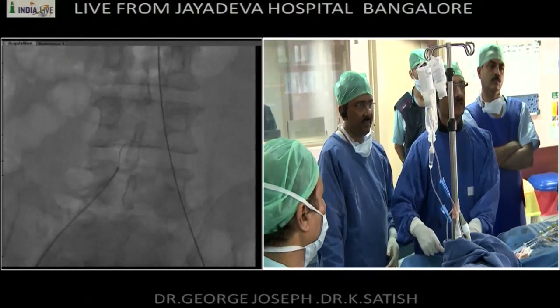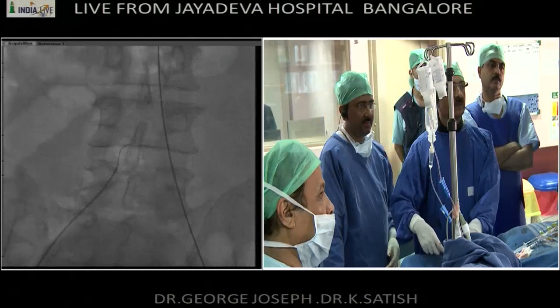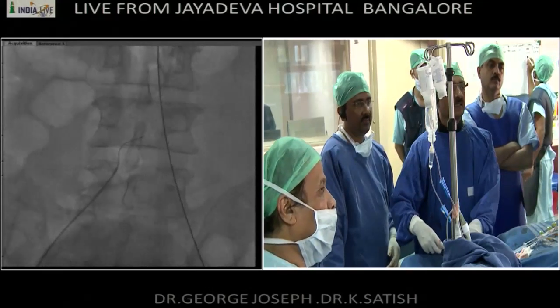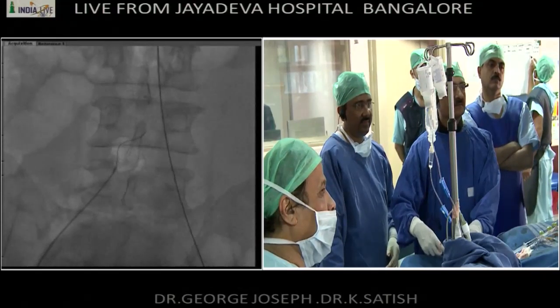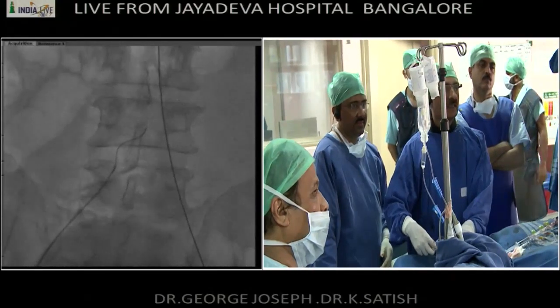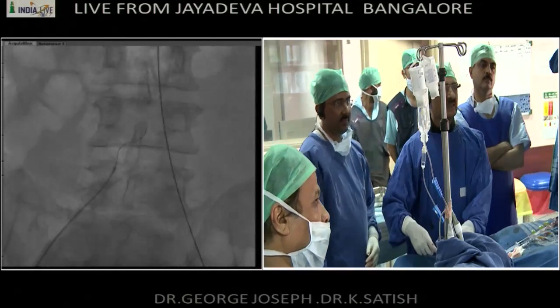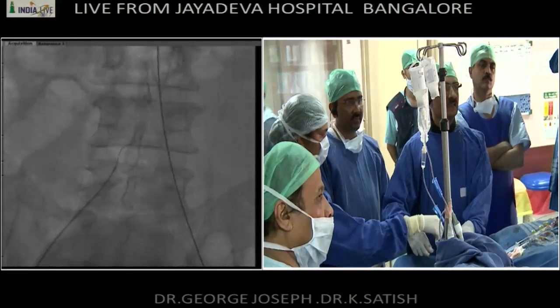At this stage, I am seeing that the wire is tending to turn its direction, and if I continue to push, it's most likely going to raise a flap. So I'll just try a little bit. If I don't get entry into the aorta, then I'll have to come antegrade. Coronary wires getting through that proximal cap, very unlikely.